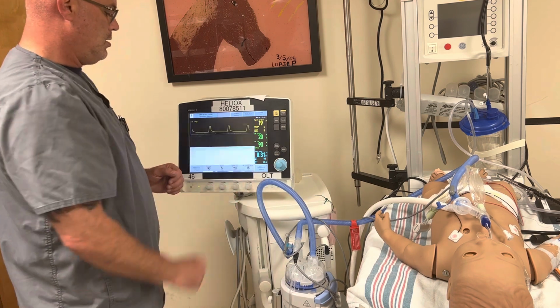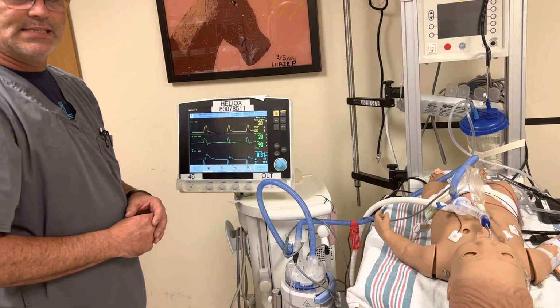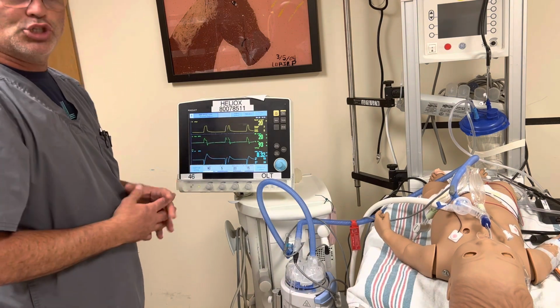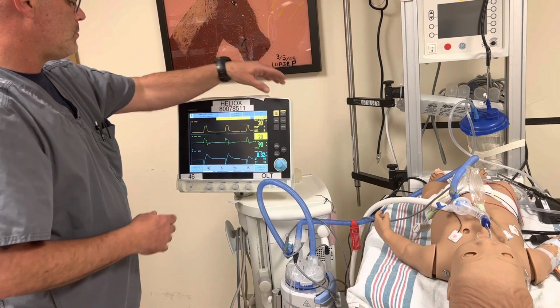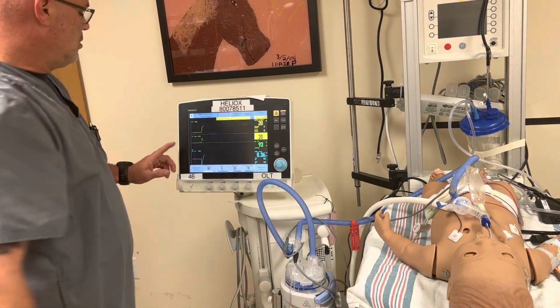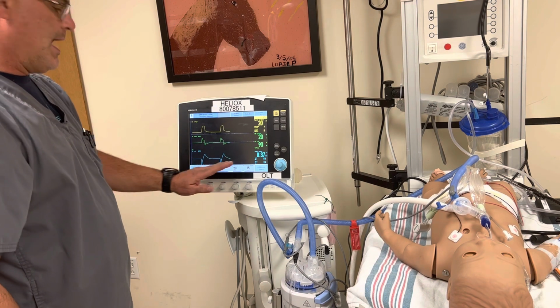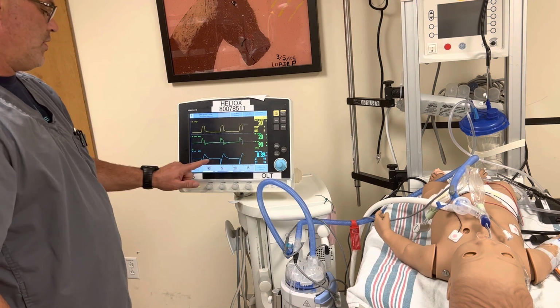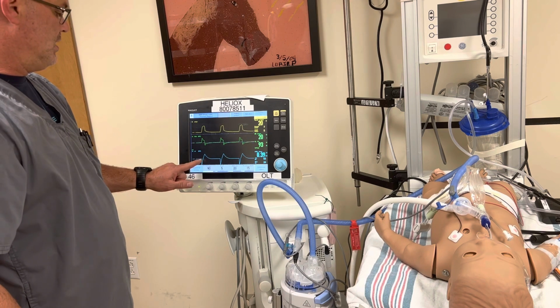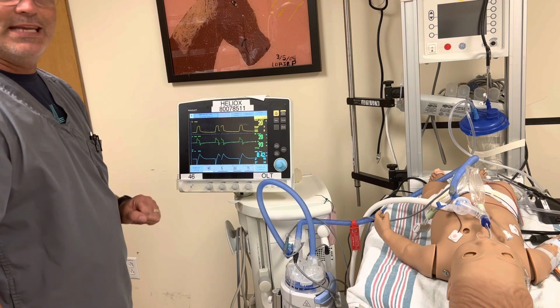In there, and then we're going to immediately look at our waveforms to manage the rest of those settings, right? So first, I'm going to look at my waveform and I'm going to immediately notice that I have a huge leak right here in front of me on the volume scalar. You see it goes up and it doesn't come all the way back to 0 on the expiratory phase, so I know I have a leak.